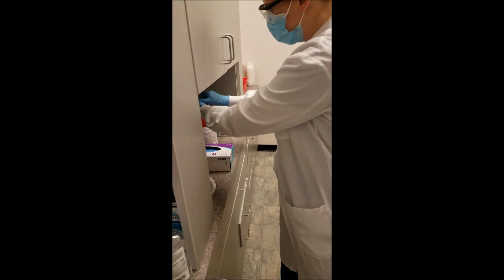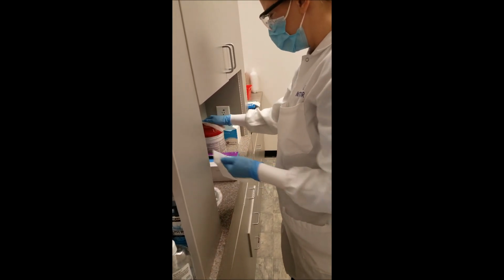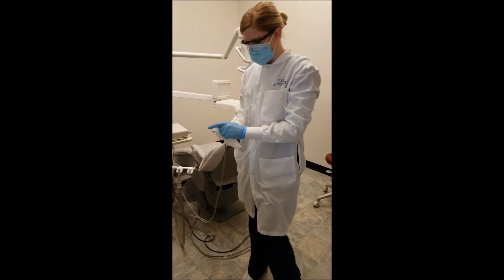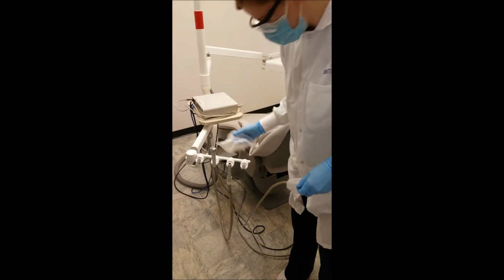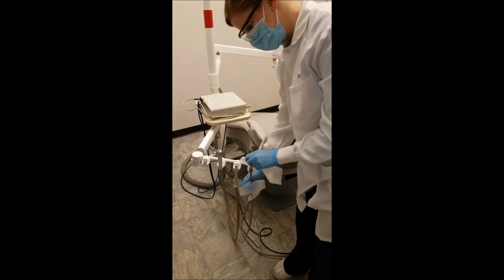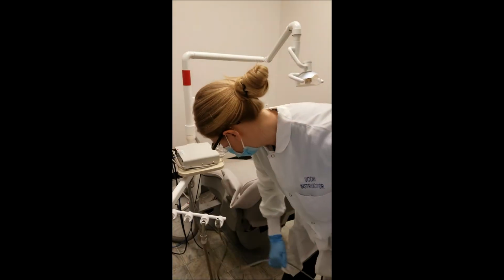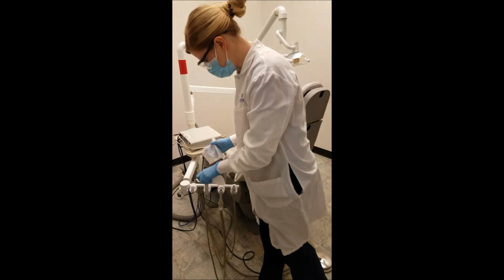Because I dropped that wipe, I am going to get 2 new ones. A helpful hint is when you are doing this, we do have it written in your PE to get 2 new wipes at certain areas. However, the rule is that anytime your wipes get dry is when you should replace them. So if that's way before the times where we've kind of designated for new wipes, go ahead and get a whole new set of wipes. Anytime it's dry, because it should last for the 5 minutes as your PE states.